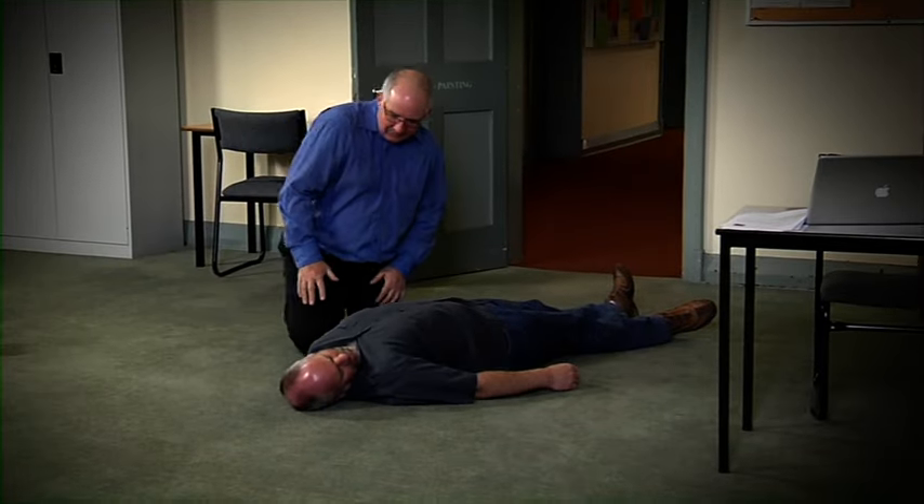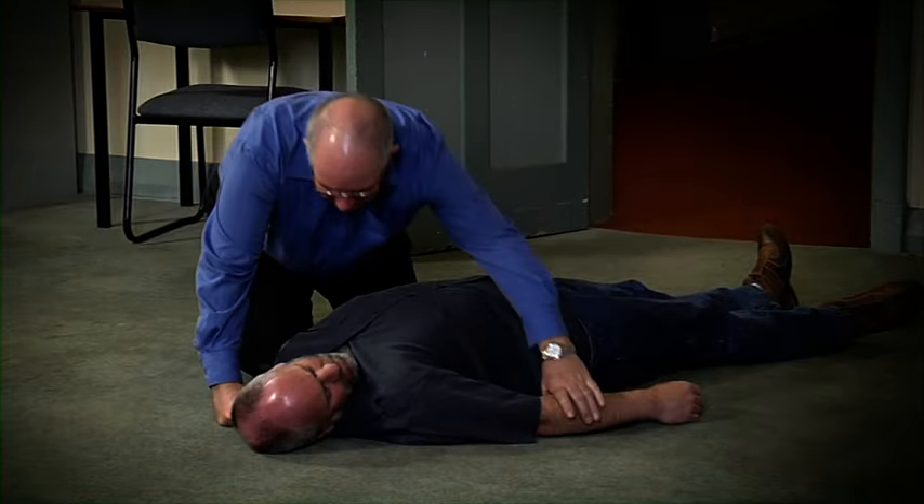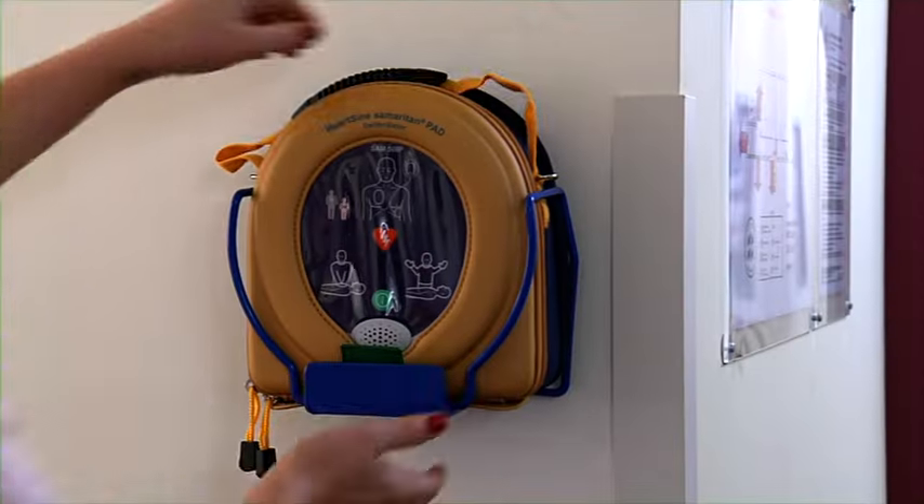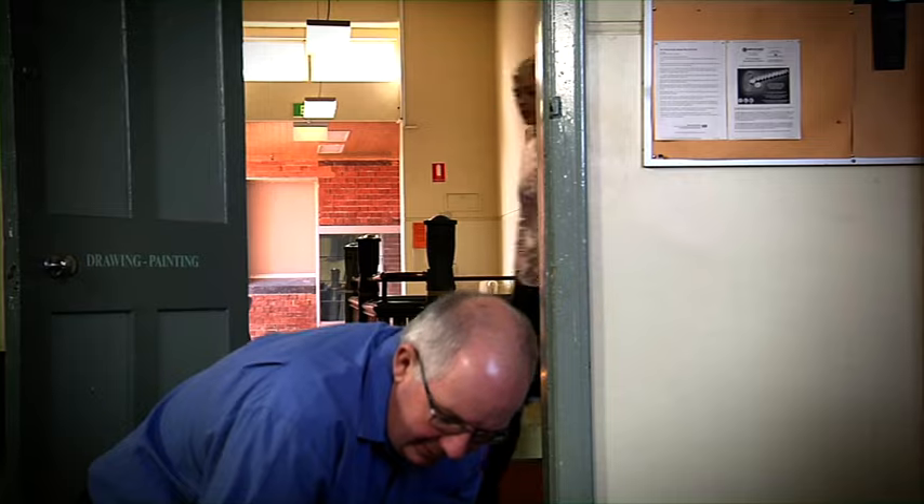If you find someone who appears to be unconscious, is not showing any signs of responsiveness and is not breathing, remain calm. Call for help, retrieve the AED and begin CPR.